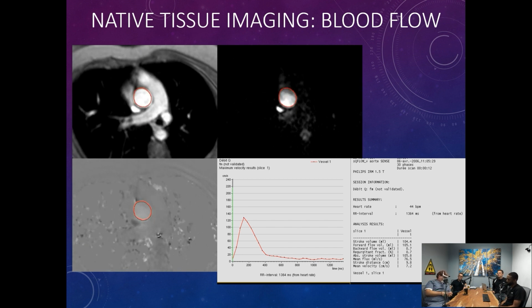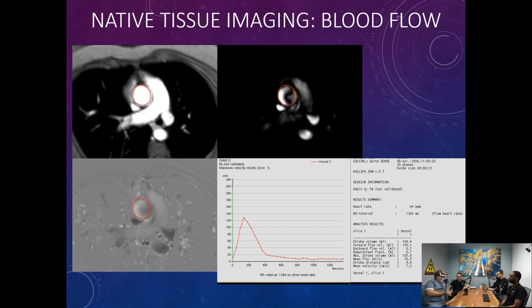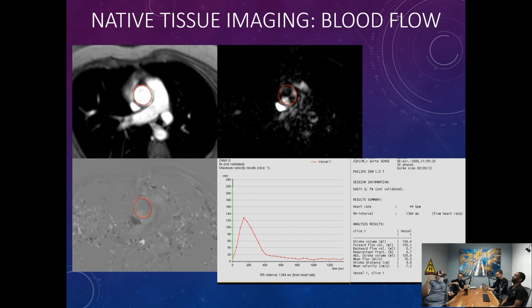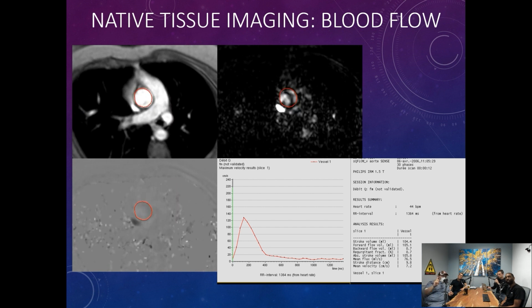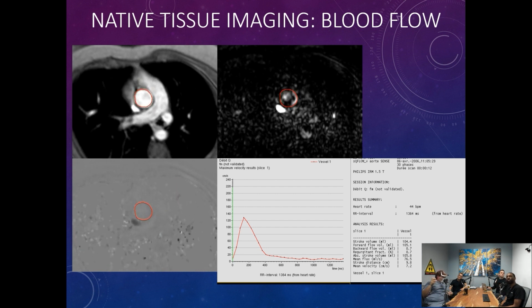And so when Francois was talking about spatial resolution earlier, that's the rate limiting step. I can tell how much signal's coming out of a voxel, but I can't tell whether it's coming from this part of the voxel or that part. For this 4D flow technique, we have all this information for all these voxels. You have this phase information of the cardiac cycle in all three dimensions, and we add them together and try to figure out what's really going on.